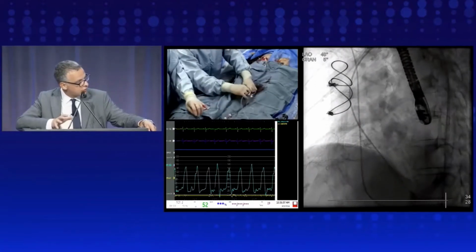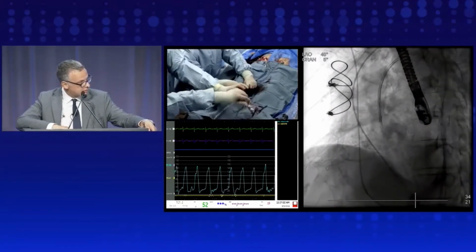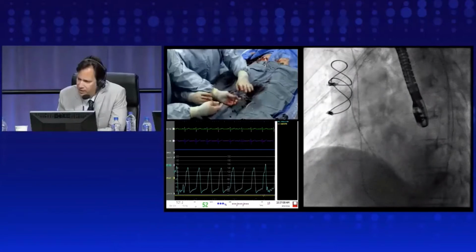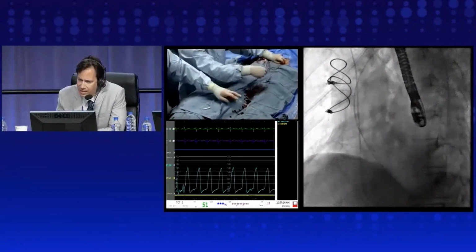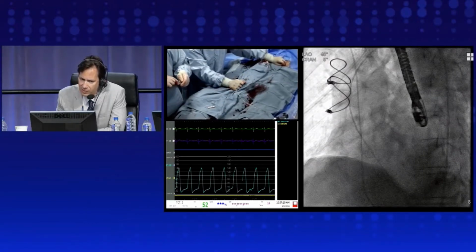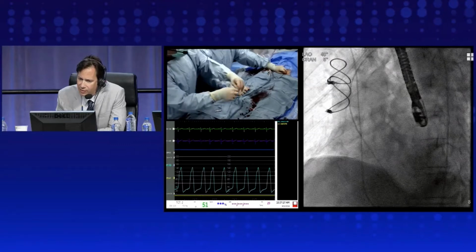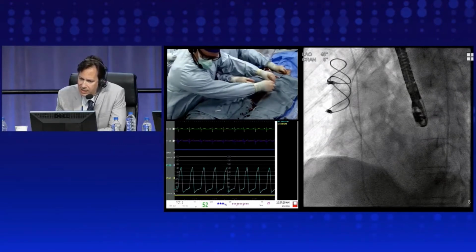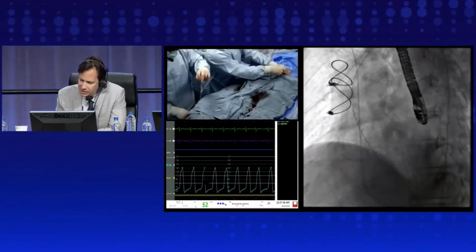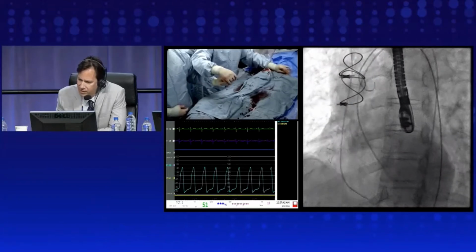So while they work, I would like to ask, maybe whoever wants to answer, but maybe you, Vasilis, do you think this should always be an echo-guided procedure? Do you need an echo in all these patients? You know, we've done it multiple different ways. A lot of the pre-procedural CT planning we did not see for this case, but you can figure out angles of projections for both the left and the right. I think also for those that had stented valves in place, it's much easier to see fluoroscopically and sometimes hard to see by TEE. I think it's nice to confirm by TEE, but sometimes you don't get as much visualization as you like. So we're using a combination, but to your question, Francesco, you could probably make a lot of this fluoroscopically driven and CT planned.